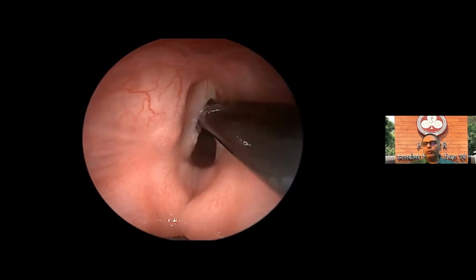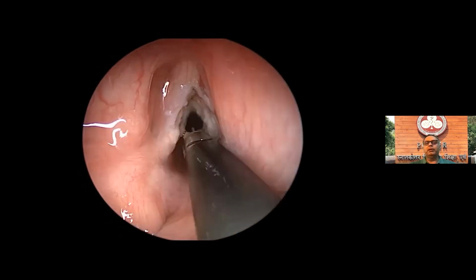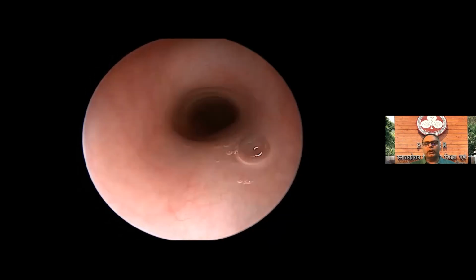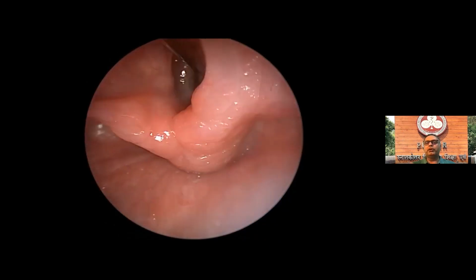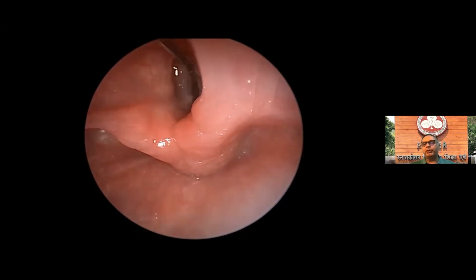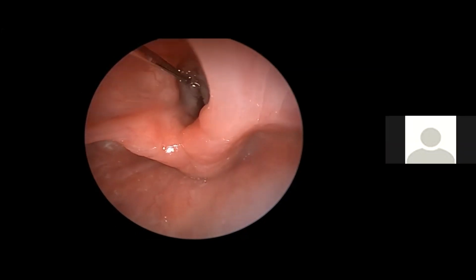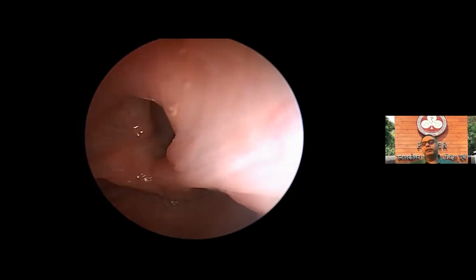So don't overdo it. We didn't take it right up till the tip. Go lower down, look into the trachea for any other anomaly that can be there. There was none, and we put a drop of fibrin glue, which we use for CSF and pituitary surgeries, onto the vocal fold. And the child has done exceptionally well.